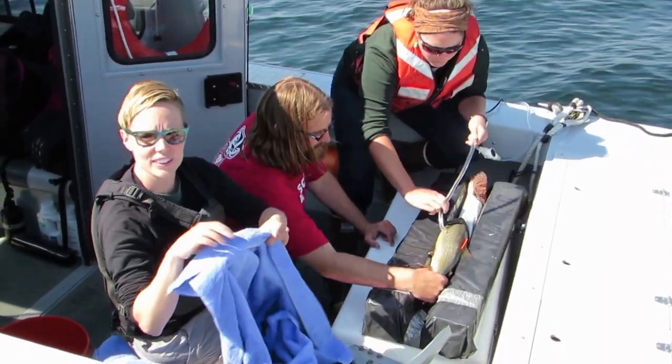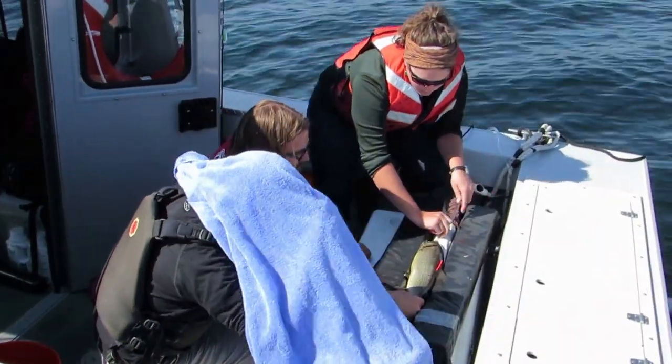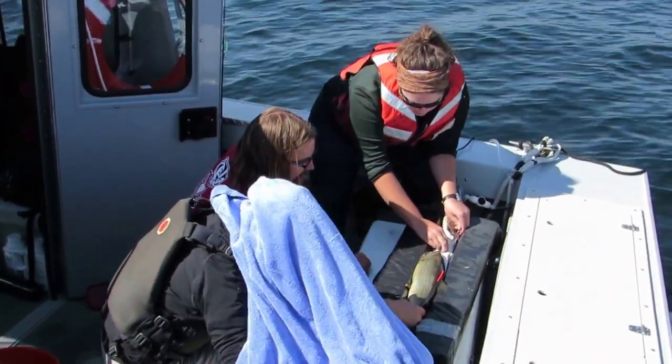I've got bad glare on the screen so I have to put my head through. The reading is 21.7.